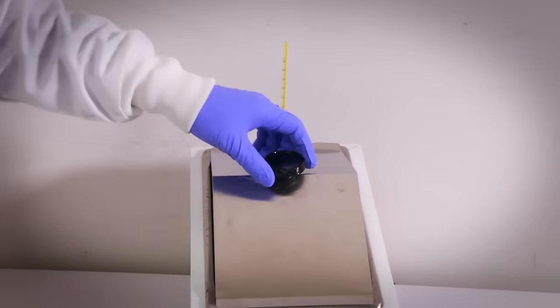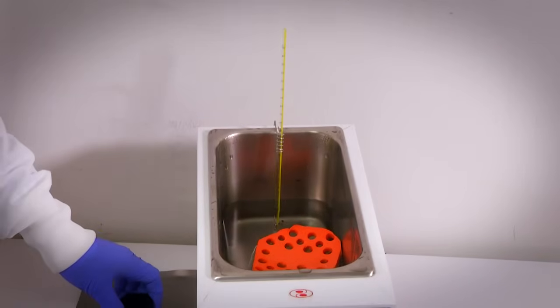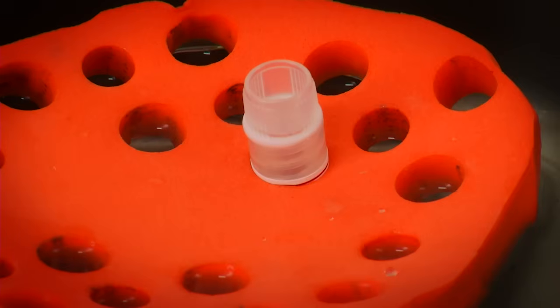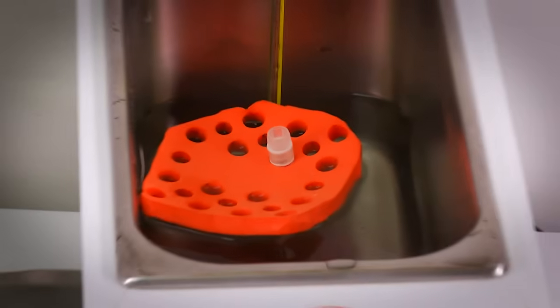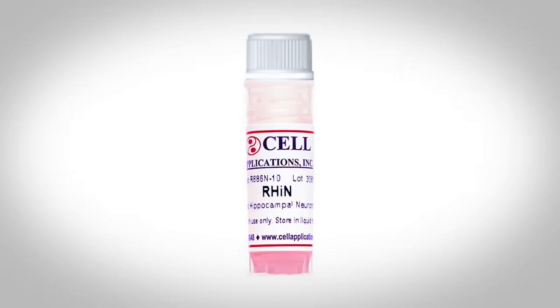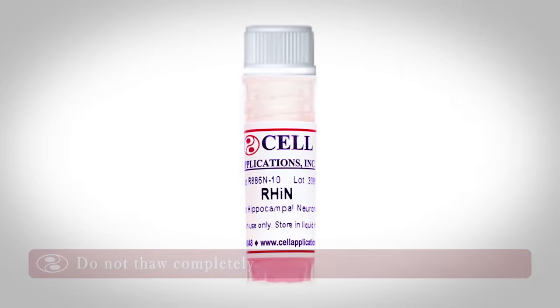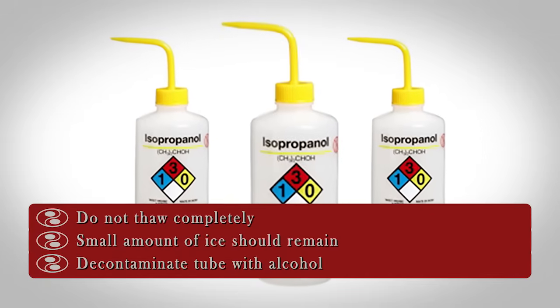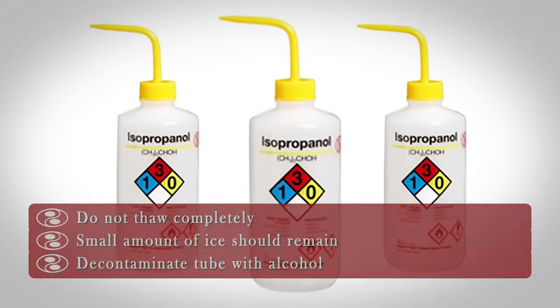Thaw the cells quickly by placing the lower half of the vial in the 37 degrees Celsius water bath, monitoring the vial closely as it thaws. Take the vial out of the water bath when there is still a small amount of ice remaining in the vial. This step takes approximately 60 to 90 seconds. Do not let the cells thaw completely. Decontaminate the vial exterior with 70% isopropyl alcohol.